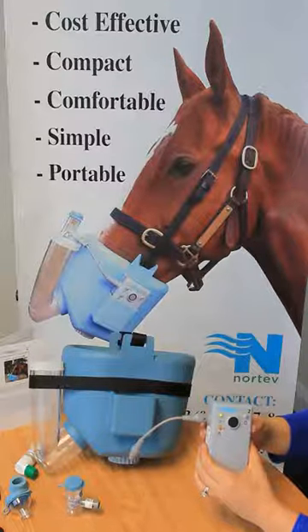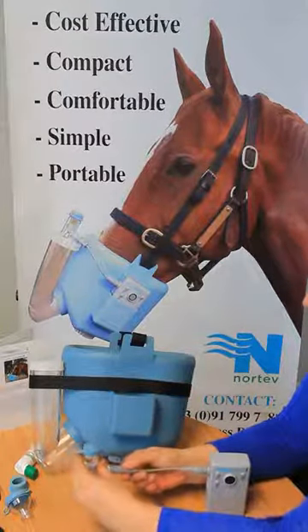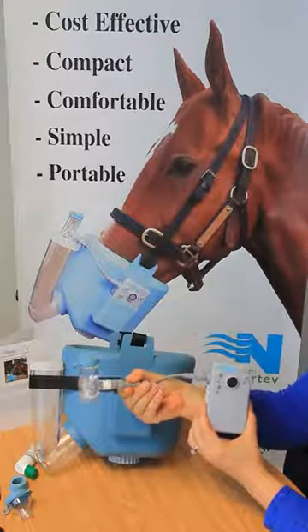As you can see, the unit is flashing red on the warning light. This is because I have no med cup attached. If I attach my med cup, the light turns off and the unit will begin to nebulize.